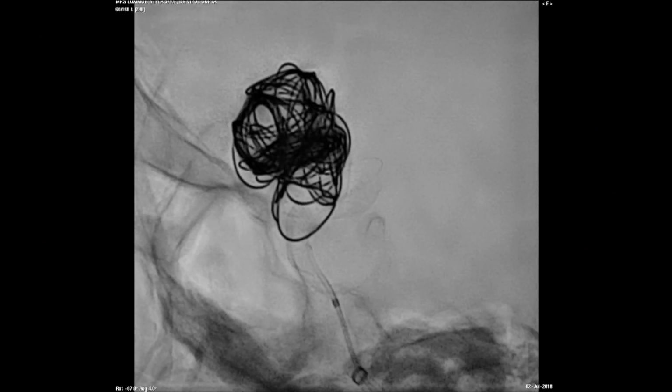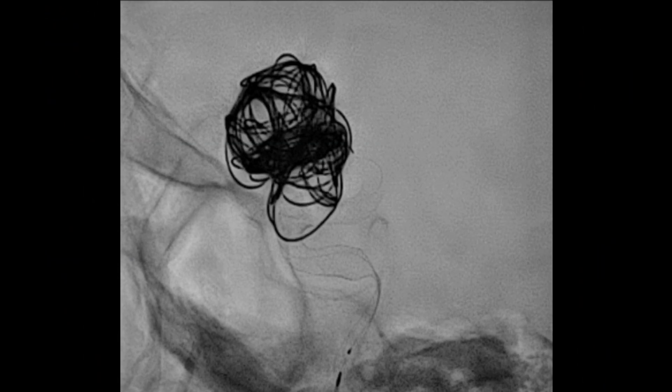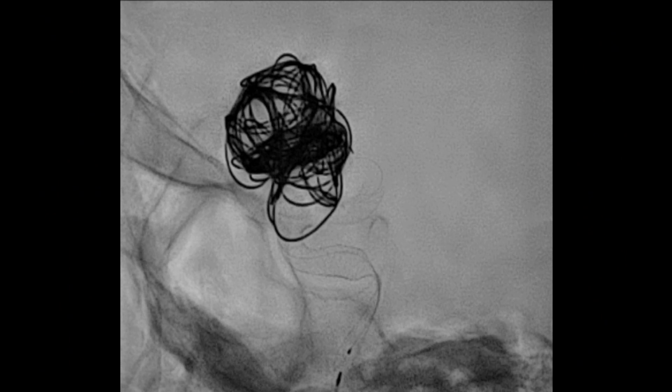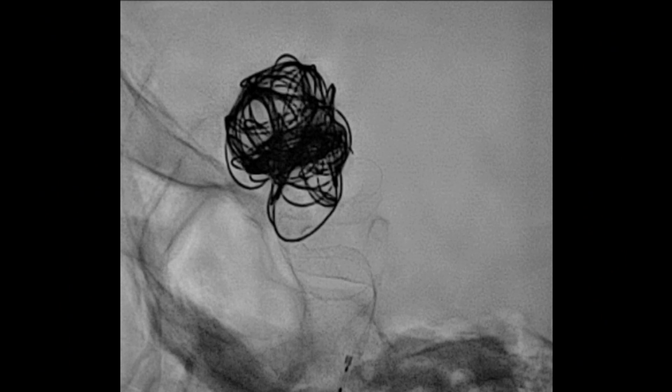Flow diverter being further delivered in the cavernous segment. After delivering, the microcatheter is pushed to open it up. The problem was distally, it didn't open up at that bend. We deployed it, and then we took the microcatheter into it, as this video will show. The microcatheter was slowly navigated into the flow diverter, and then the tug of the wire opened it completely.